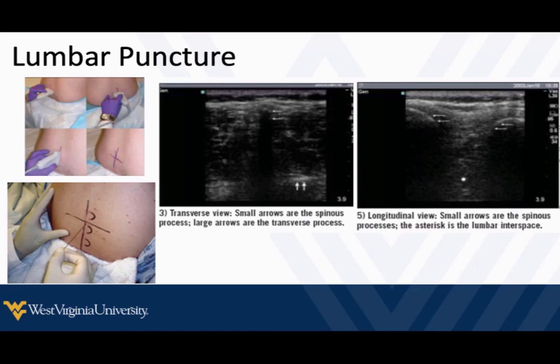If we're using the linear probe, in the transverse view we're going to see the spinous process and take note of how deep it is — here it's very superficial. It's just a little bony edge that casts a spike-like shadow down deeper into their tissue. We can also see the transverse processes, but that's our spinous process. We'll line that up in the center of our screen using a center marker, or hit the M-mode button to drop a line right down the middle, then mark their skin with a vertical mark. Then we turn and look at the spine in long axis to confirm those spinous processes are at the same depth as in the transverse view.